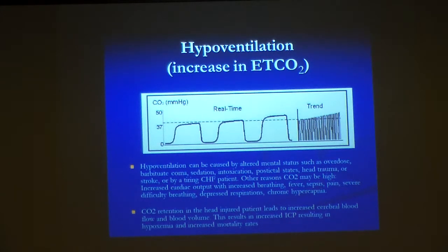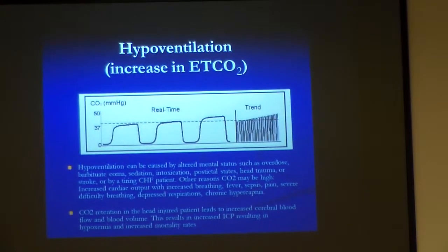So that is the kind of waveform that you're going to see on a patient who's hypoventilating. Maybe they're on sidestream, maybe they're an overdose, you put them on end-tidal just to see where they're going. You gave them Narcan, they were doing okay, and you know how it goes, they kind of start going down again, and you'll start seeing their end-tidal CO2 rise again because they're hypoventilating. They're not ventilating efficiently. So that's going to be your trend, and that's how it's going to look.